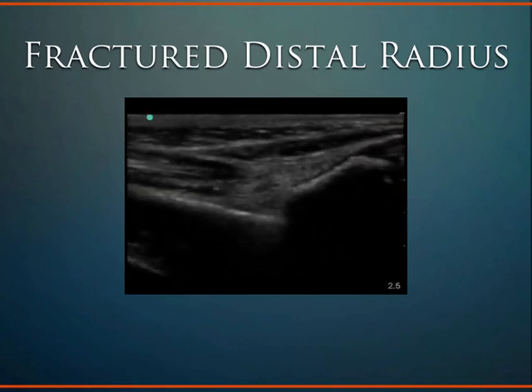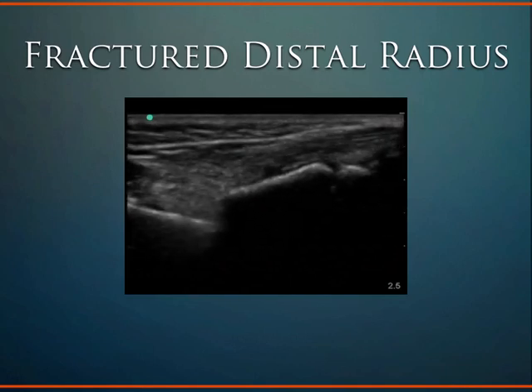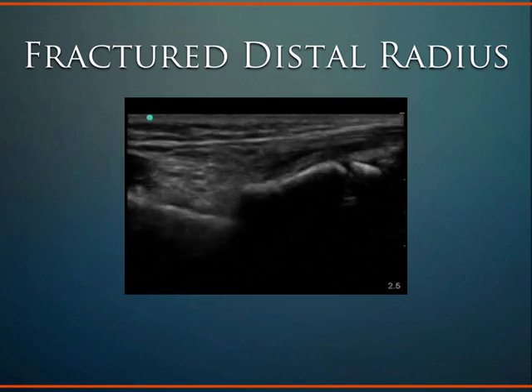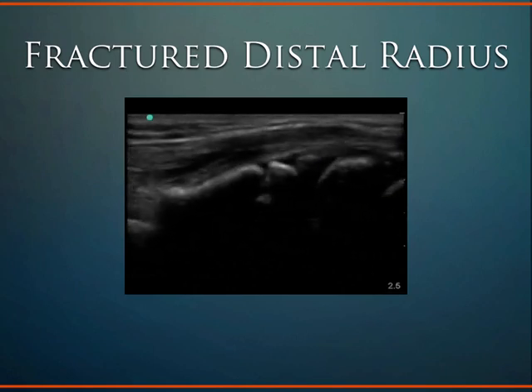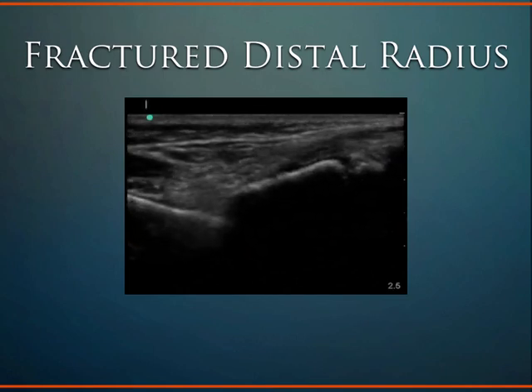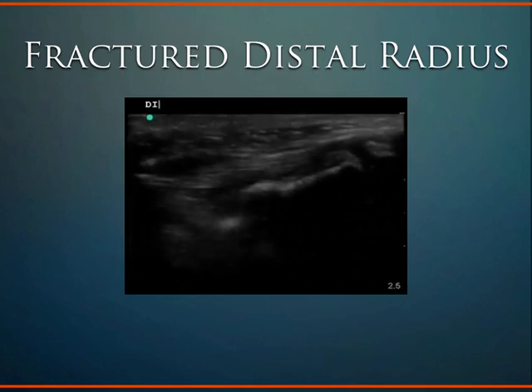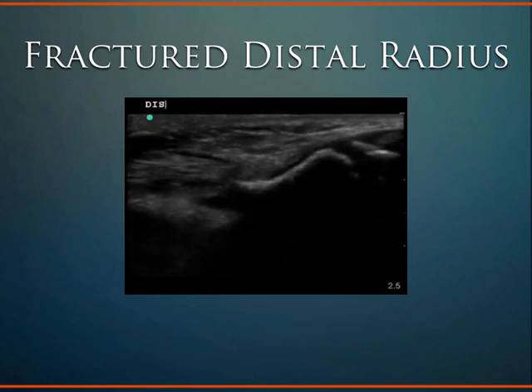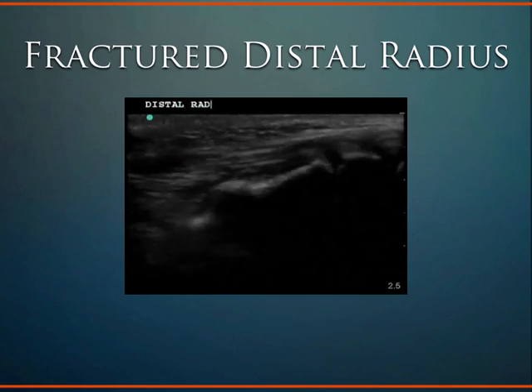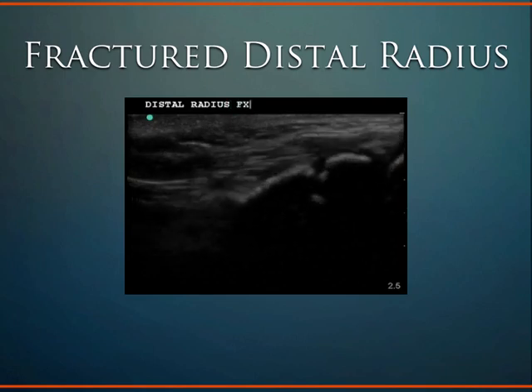Is it really painful for the patient to ultrasound a bone fracture? Not so much, and you actually use the site of maximal tenderness as a guide to where to image on the bone as kind of your protocol to find it. There are different tissues, or different regions of the body, where you do have to put a little pressure. But most of the time, especially with these forearm bones or bones that you're typically going to image for fracture visualization, you don't really have to push that hard.